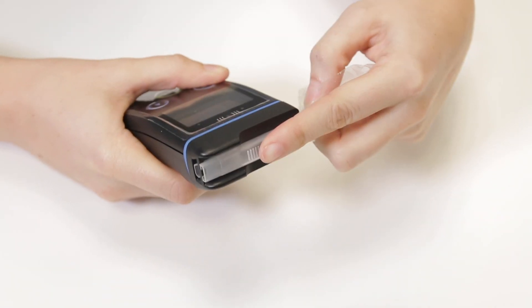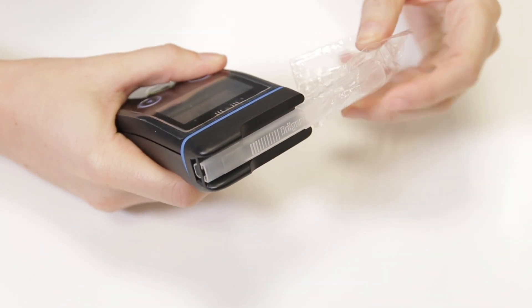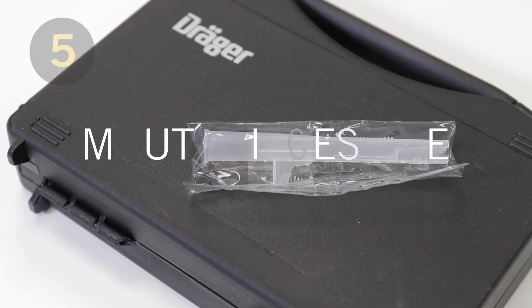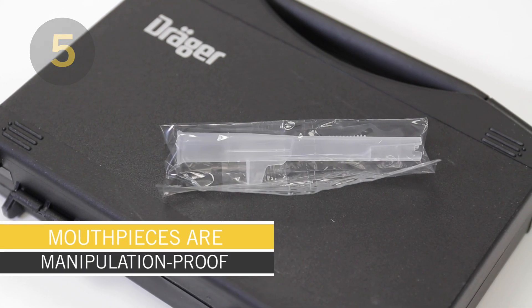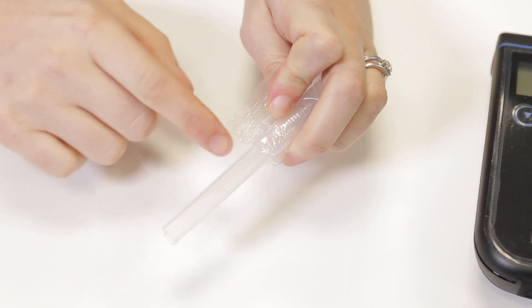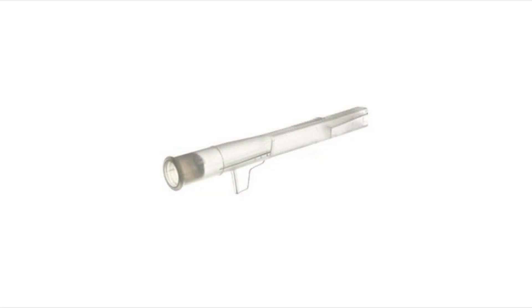To use the device, all you need to do is insert the slide and click mouthpiece and blow. The slide and click mouthpieces are individually packaged and patented to prevent any manipulation attempts. A mouthpiece with a non-return valve is also available, and this version is extremely hygienic.